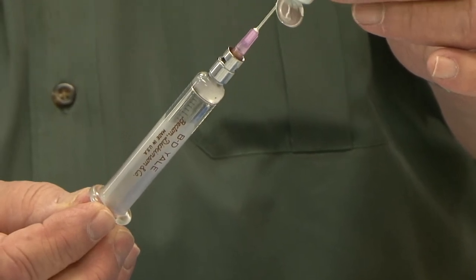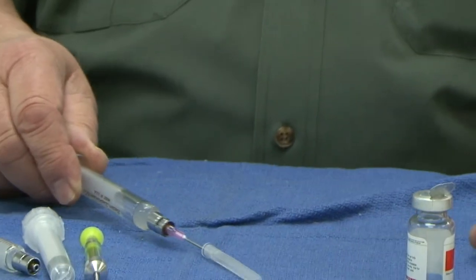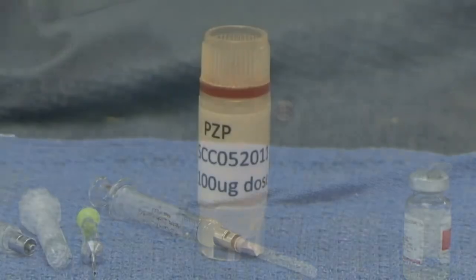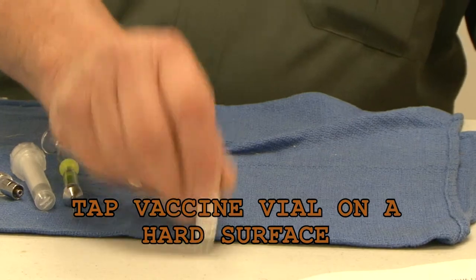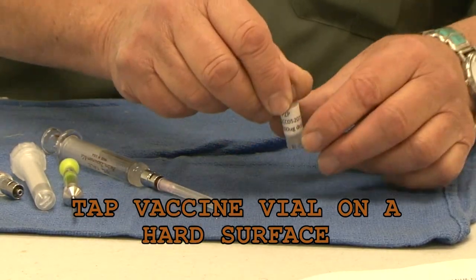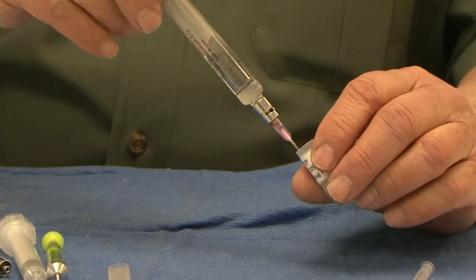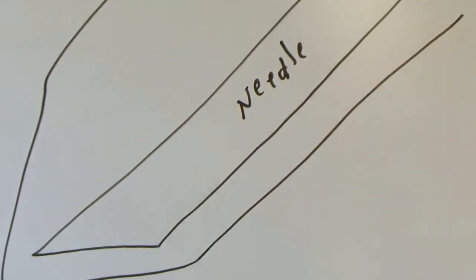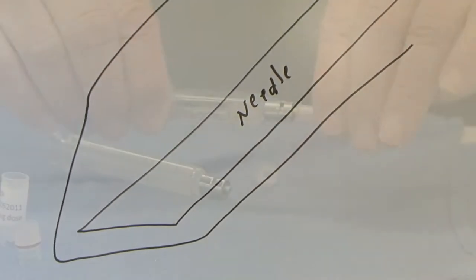Always draw the adjuvant up first. After removing the needle from the adjuvant vial, be careful not to lose the adjuvant due to an uncontrolled sliding plunger on the syringe. Now take the vial of thawed vaccine. Tap it on a hard surface to prevent any vaccine from clinging in the cap. Open the vial and carefully draw out the vaccine into the syringe with the adjuvant in it. Get every last drop by making sure the bevel on the needle is flat with the tapered bottom of the vial.